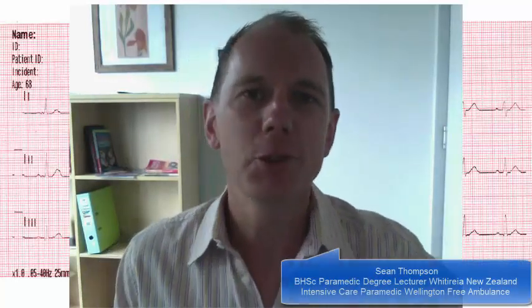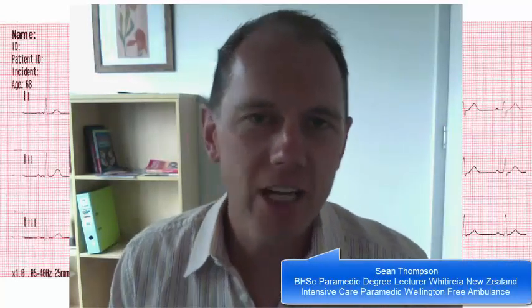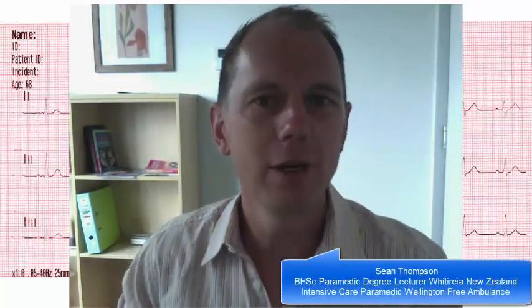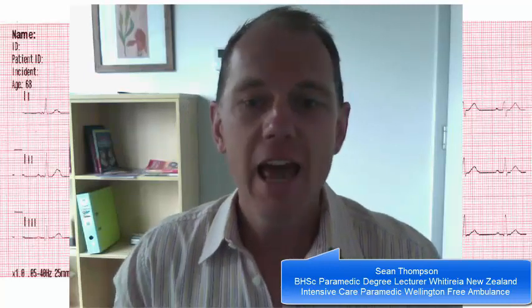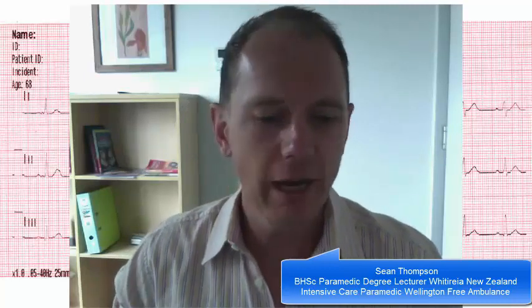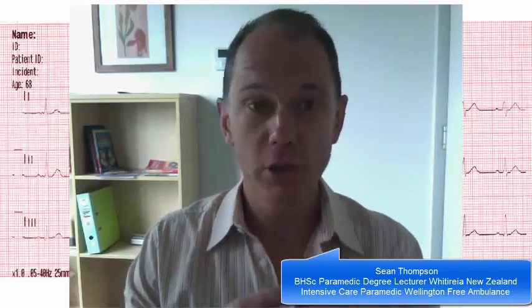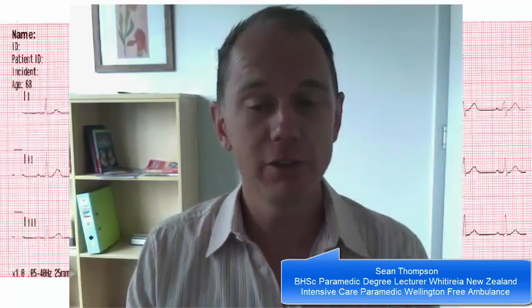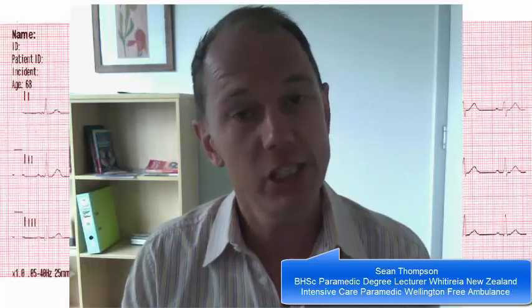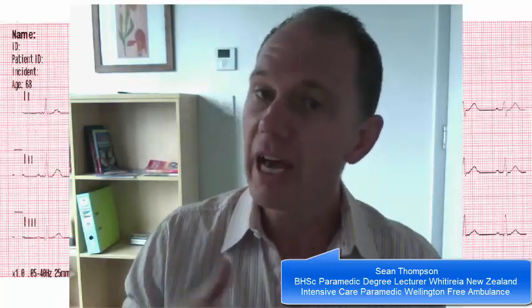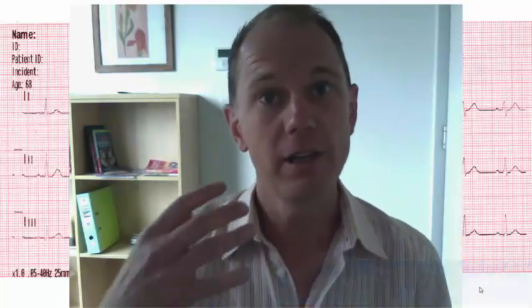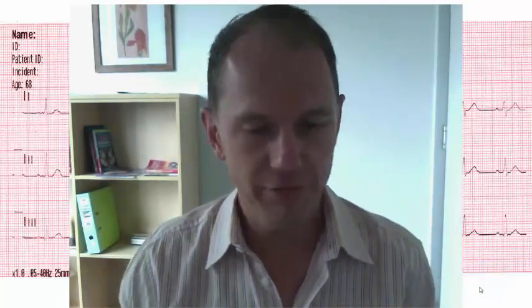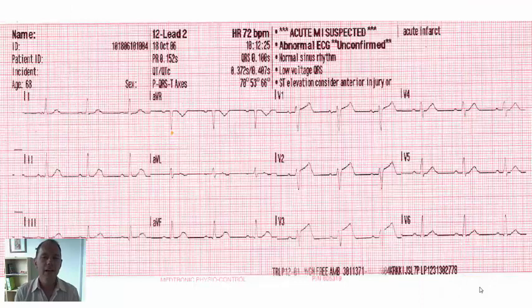Hi everyone, my name is Sean Thompson and today I'm just going to take you through a little introduction on how to interpret the regions of a 12-lead ECG and also how to relate that back to the actual anatomy of the heart.